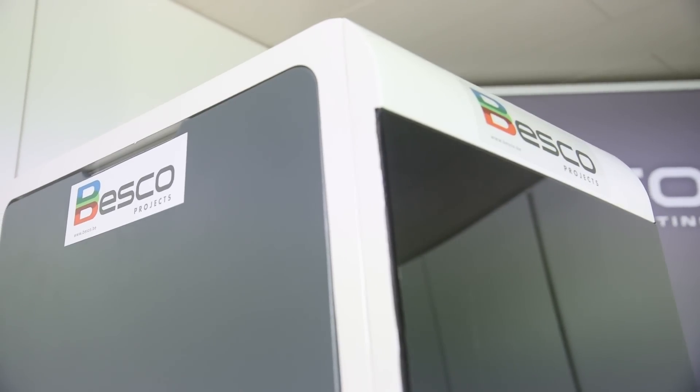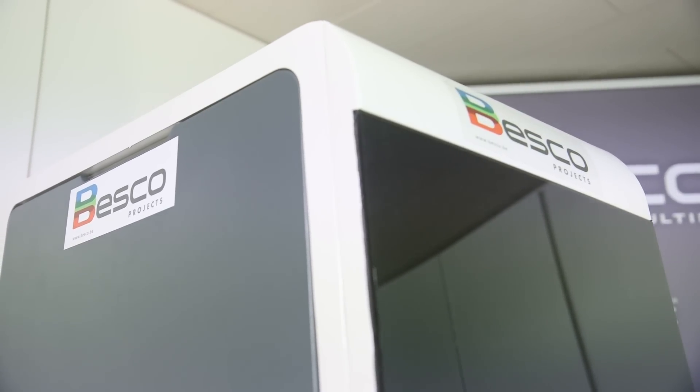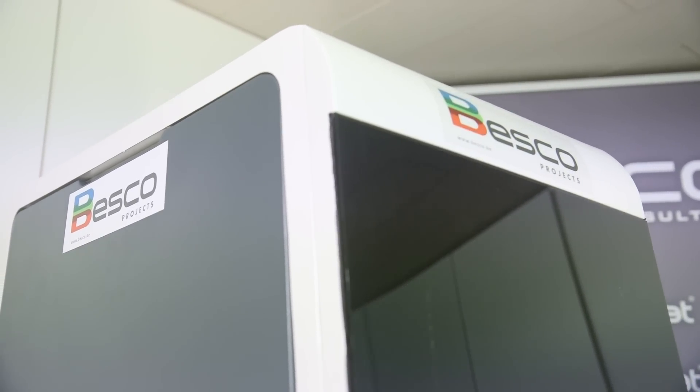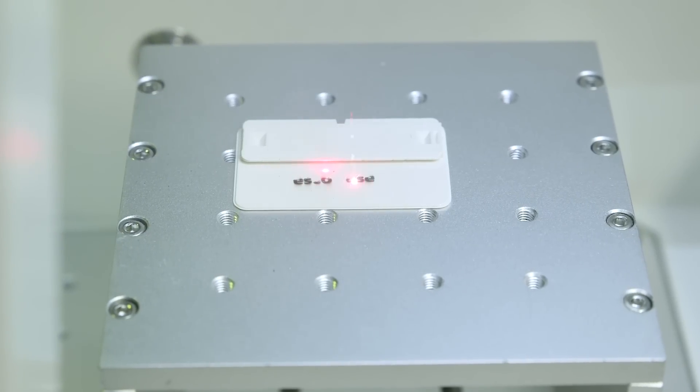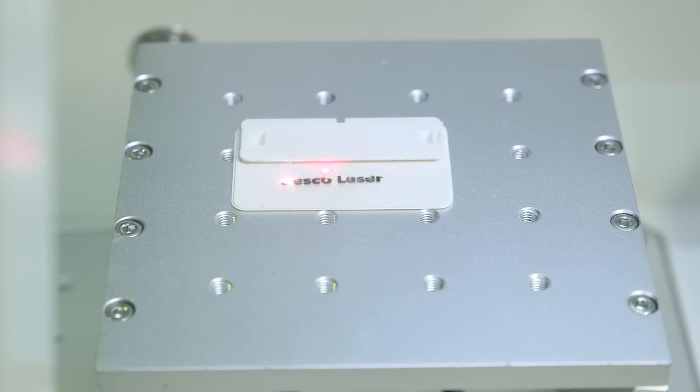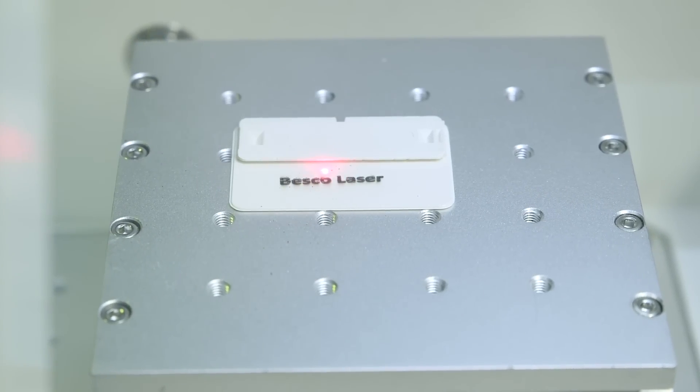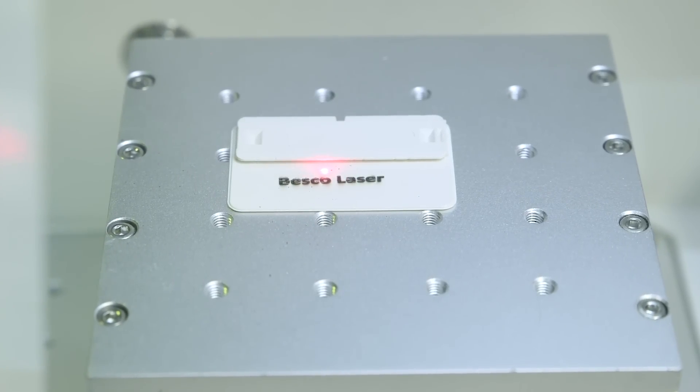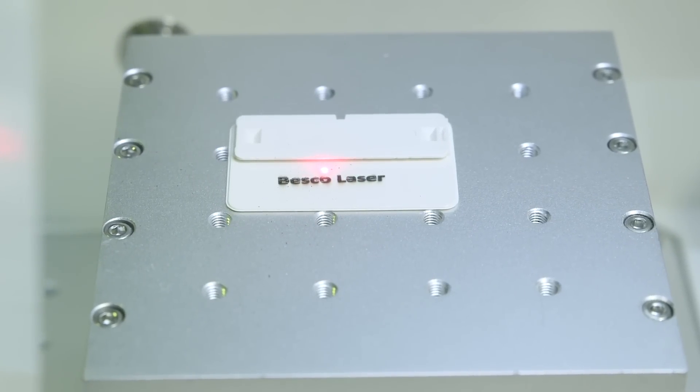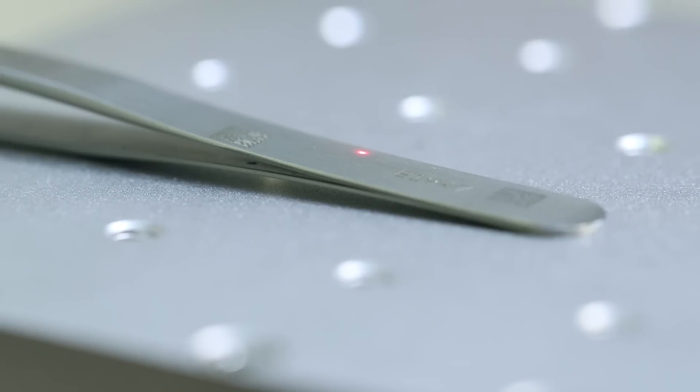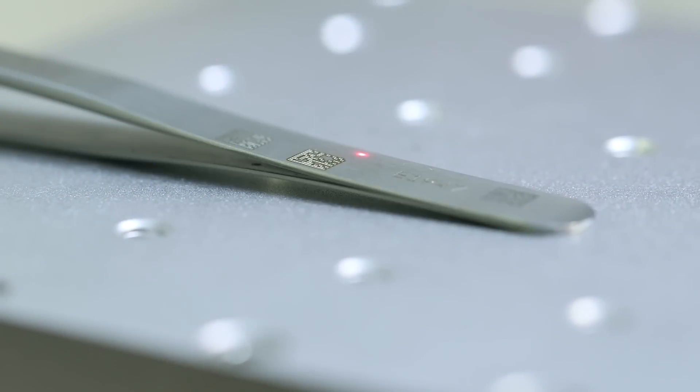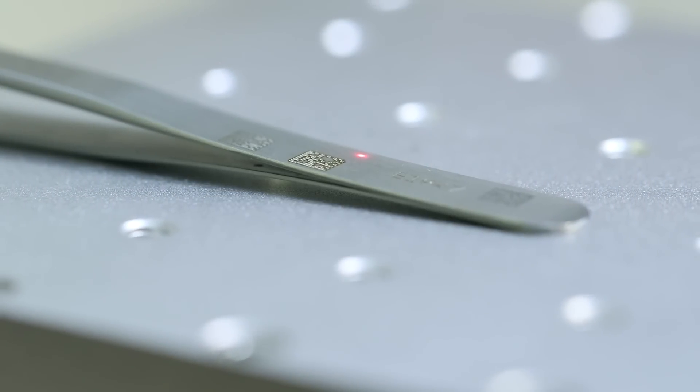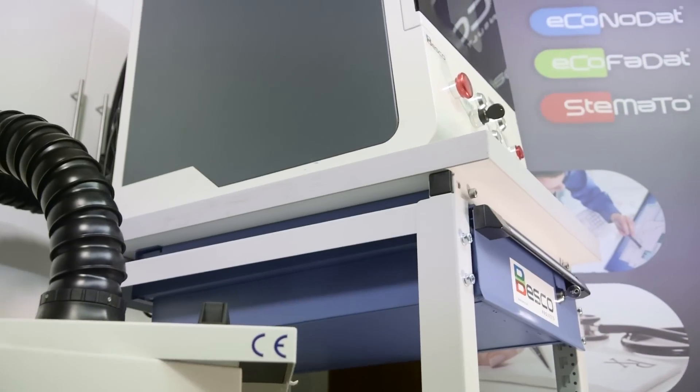Besko Laser Concept Hard and Software. The Besko Fiber Laser is a highly configurable compact laser unit designed for the hospital environment, offering the widest range for surgical instrument marking capability in its class.